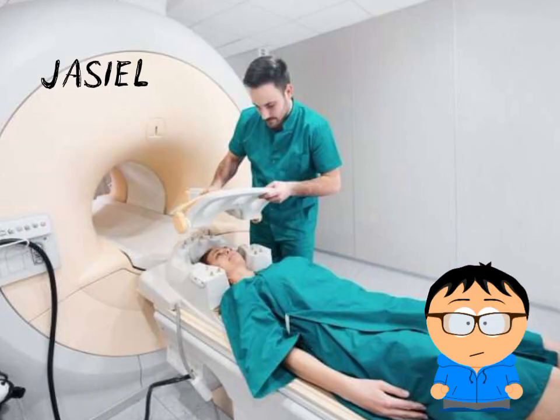Magnetic resonance imaging is an advanced device that uses a magnetic field and radio waves to create images of organs and tissues inside the body. Unlike other imaging devices that use radiation, magnetic resonance imaging is non-invasive and does not expose patients to ionizing radiation. The main parts of a magnetic resonance imaging system include: 1.